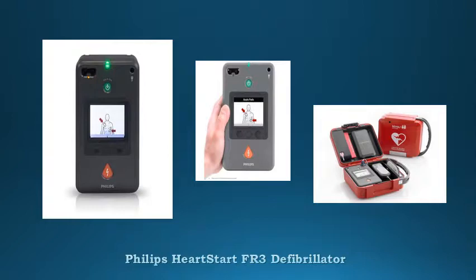Preconnected peel and place SmartPads 3 with no foil pouch to open, reducing deployment time. Small, lightweight, and easy to maneuver in tight places.